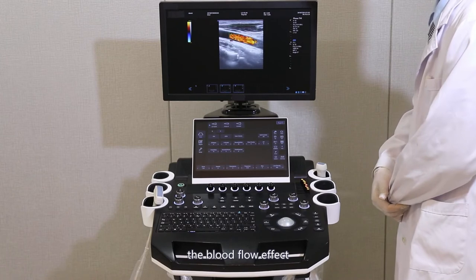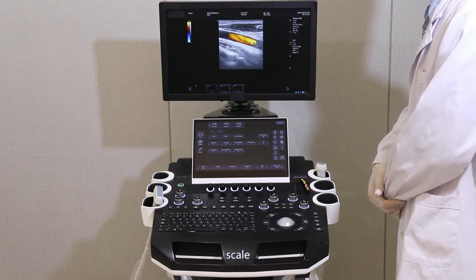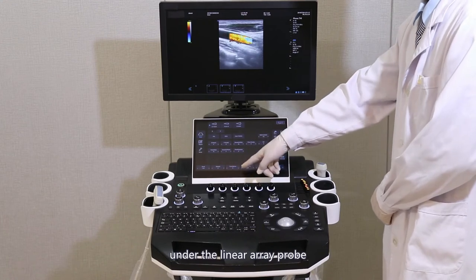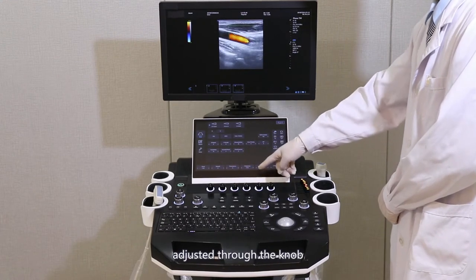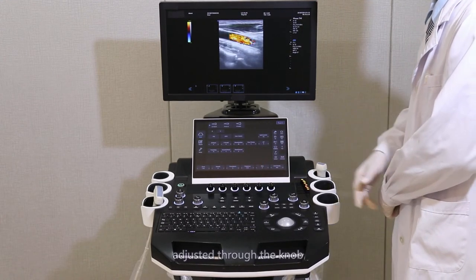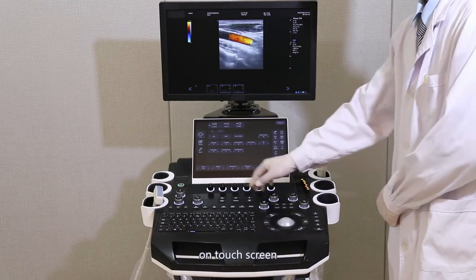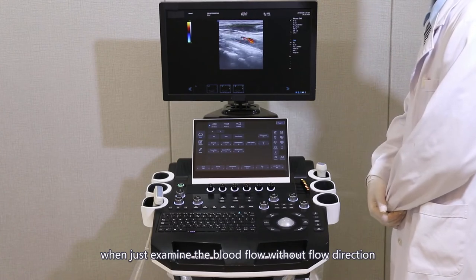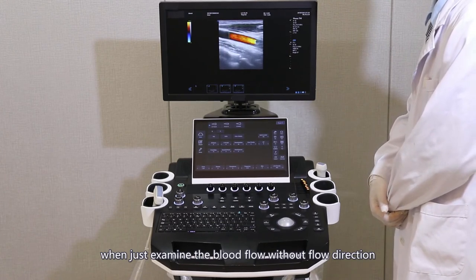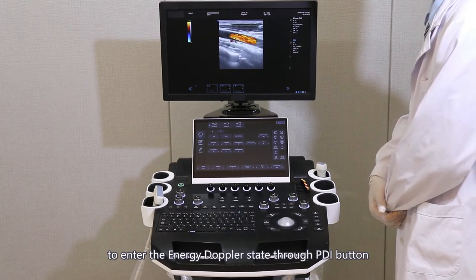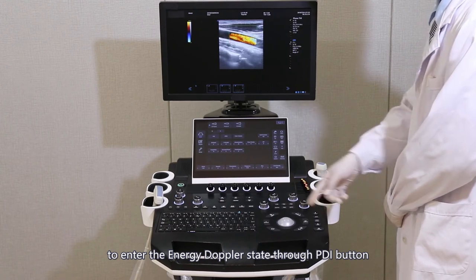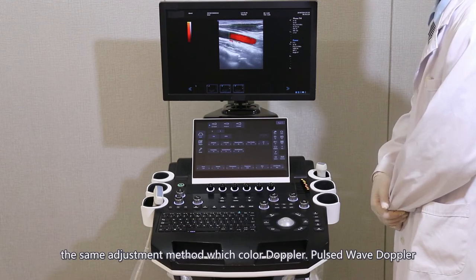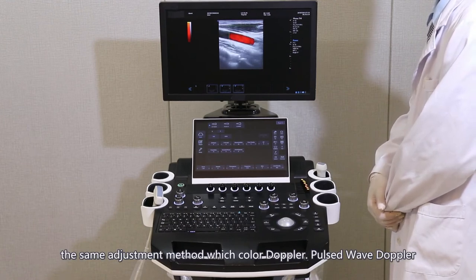Press the SET button again to change into a solid line; move the trackball to adjust the position. The blood flow effect, scale, and deflection angle under the linear array prop can be adjusted through the knob on the touch screen. When examining blood flow without flow direction, enter the energy Doppler state through the PDI button under C-mode, with the same adjustment method as color Doppler.